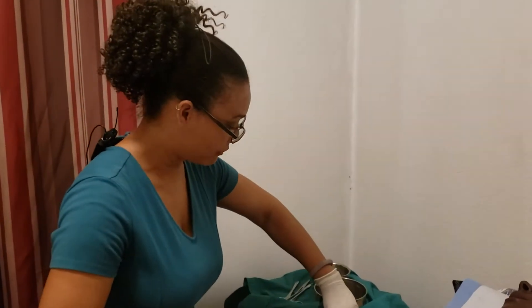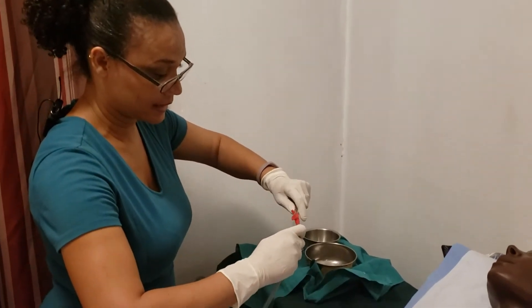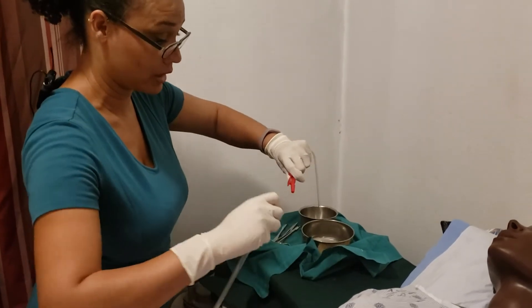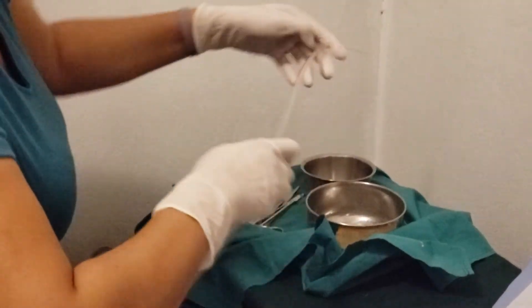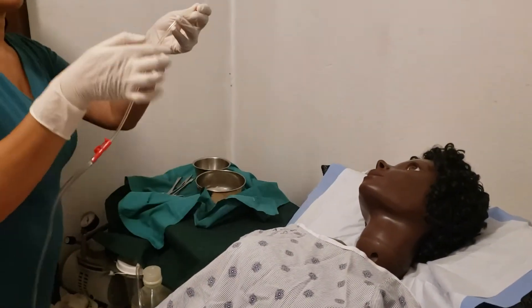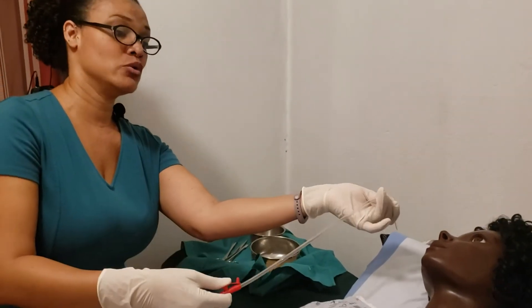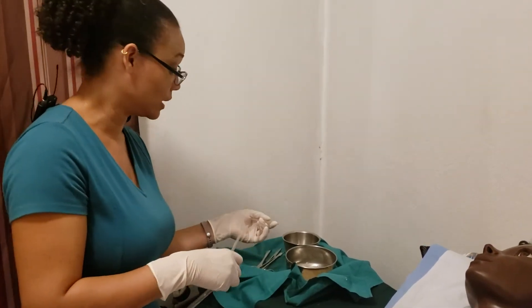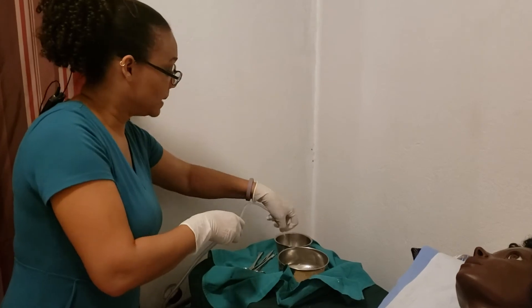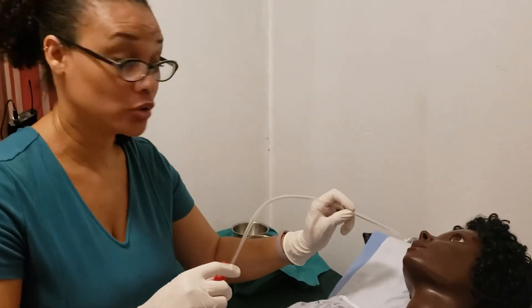Now I've grabbed my tubing, hold it and connect it to the suction machine. Remember, I have a clean hand and I have a sterile hand. Once I've got that connected, I will go ahead and measure approximately how far down I would want the catheter to go with my patient. You go from the ear to the nose, from the nose to the neck, and that gives you approximately how far down is your maximum. Just lube the end of it and then we are going to go in to the nare.